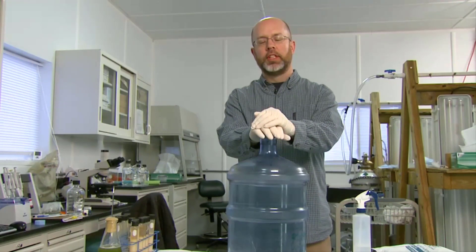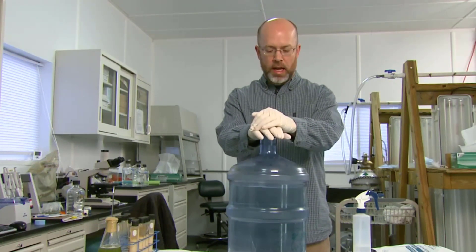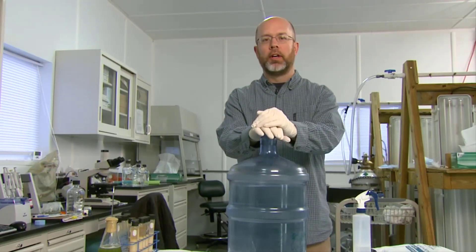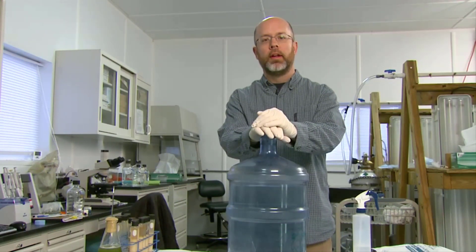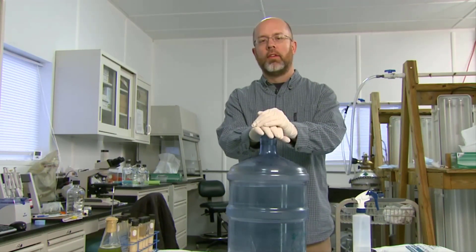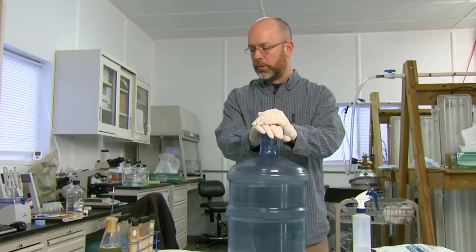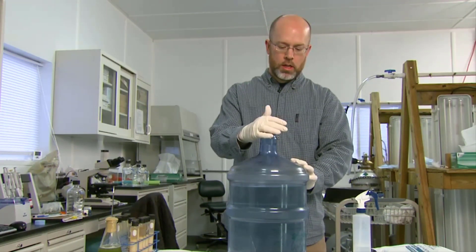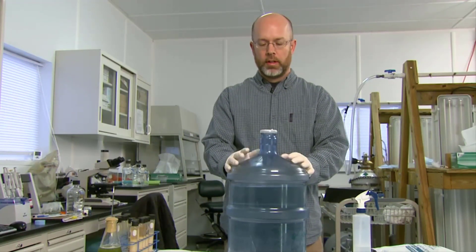You may even want to consider, if you're using sensitive algae cultures or something you really need to be careful with, taking a water sample and testing it with a chlorine strip — especially if this is the first time you're doing it — just to make sure you have all that Clorox out of there. Because even just a small amount of Clorox in your water is going to kill the culture as soon as it hits. So let this sit for about an hour, test it if you're concerned, and then we'll proceed from there.